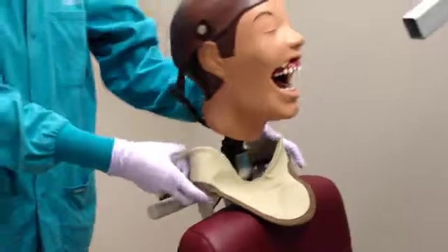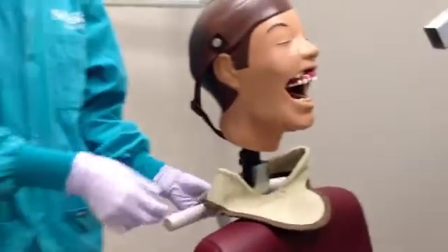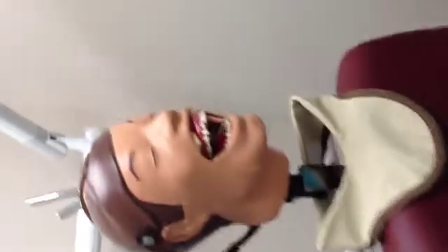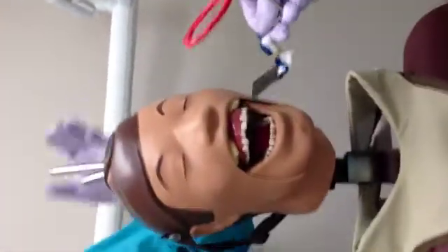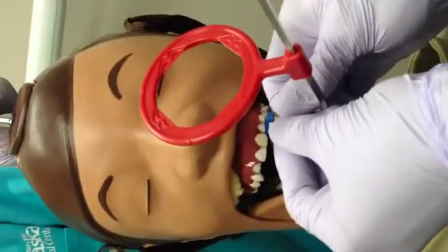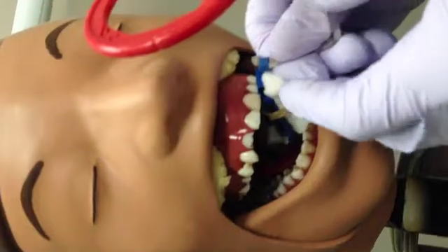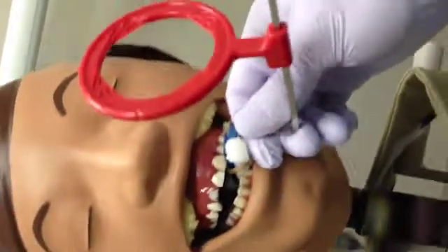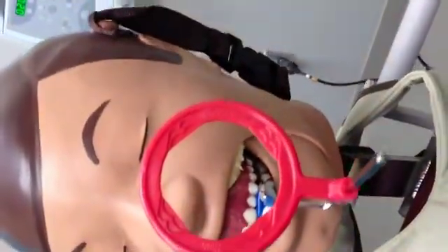Put the thyroid collar around the patient's neck. Now the instrument is ready to be placed in the patient's mouth. The entire tooth must be in the radiograph, including the entire crown and apex. At least 2 millimeters of bone needs to be captured around the entire tooth. To do this, the plate should be parallel to the lateral incisor and centered, making sure that the whole tooth is in the shot.